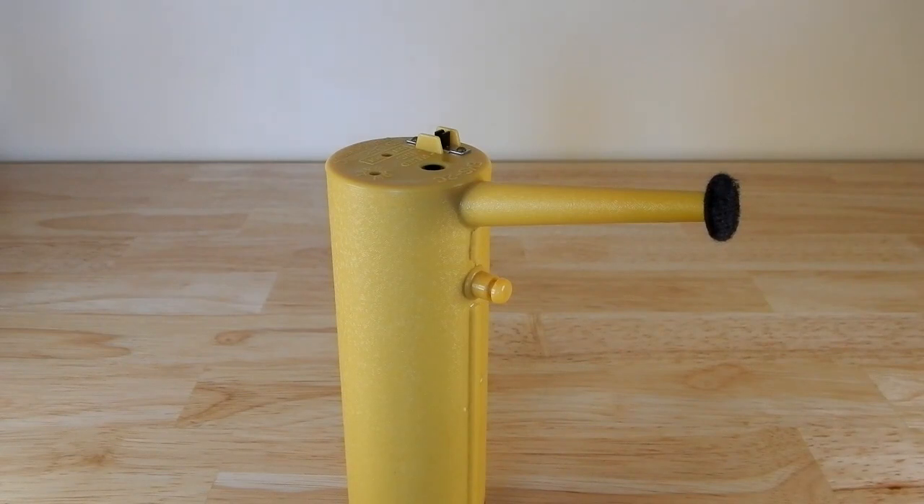Today I want to take a look at this item that I got from Medlabs. It is their model EMS-2C, and it is called a Muscle Neuromuscular Stimulator.